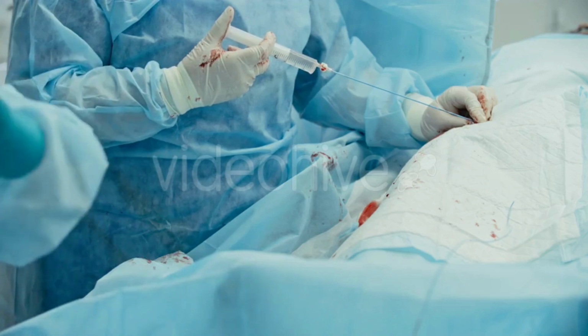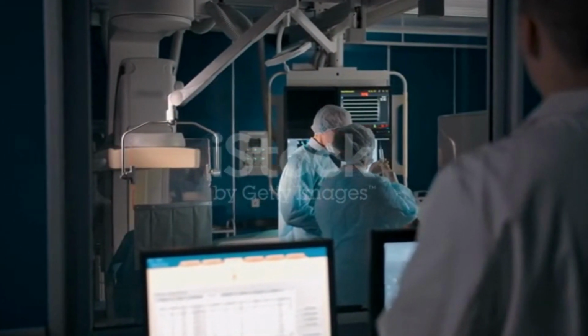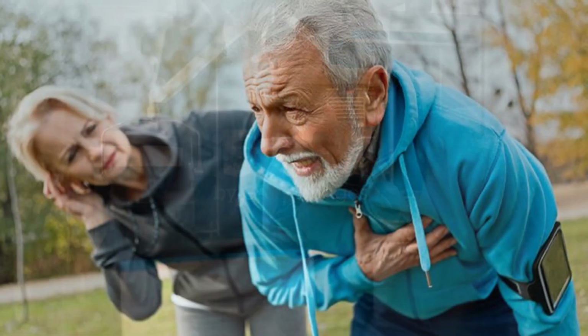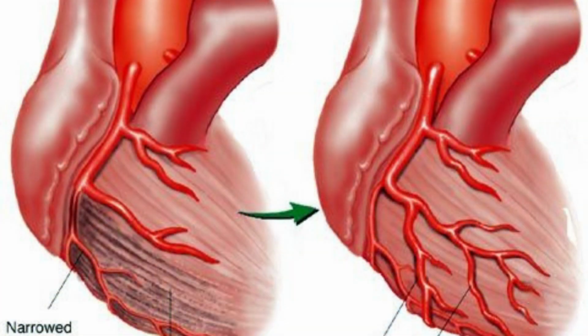Your doctor may recommend a coronary angiogram if you have symptoms that suggest you aren't getting enough blood to your heart, such as chest pain or a heart attack. You might also have a coronary angiogram if you have a congenital heart defect, if you have had a significant injury to your chest, or if you have problems with blood vessels elsewhere in your body.